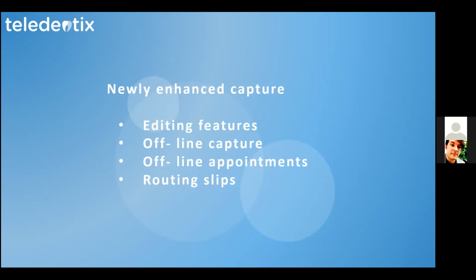All right, so I'm going to go ahead and stop sharing my screen here so that I can share my other screen with my Teledentix account, so I can start my capture. All right, so just a second here.